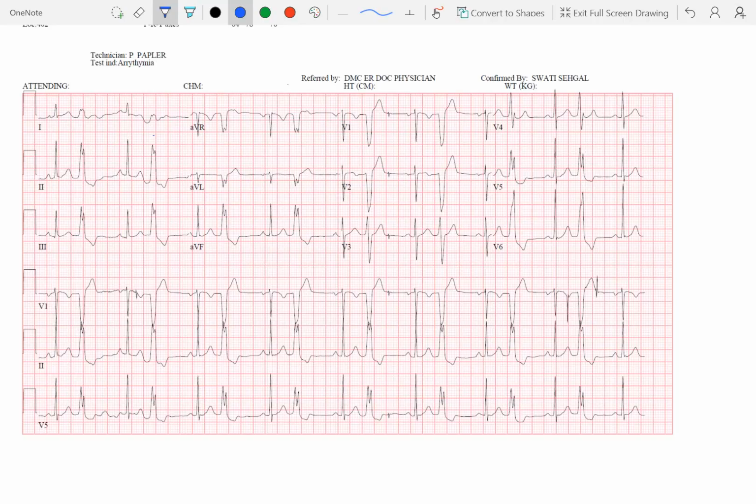All right, so how old was this patient again? 15 years. So we have a 15-year-old young lady who has cough and congestion and the clinical signs and symptoms suggestive of right middle lobe pneumonia, who incidentally on the ECG was noted to have this rhythm. So clinically hemodynamically stable, I'm presuming. Yes. She was having a little bit of trouble breathing, had maybe a slight increase in her respiratory rate, but that was about it. And was she feeling any palpitations at all? She thought occasionally that she was, yes.